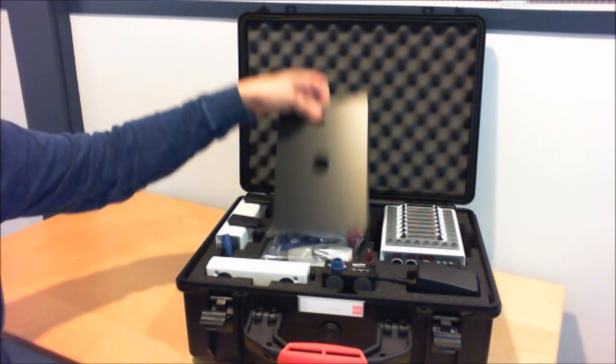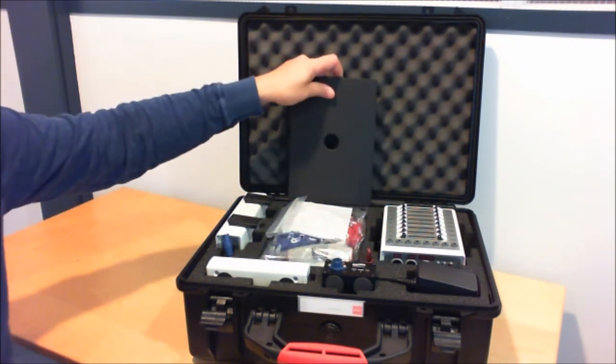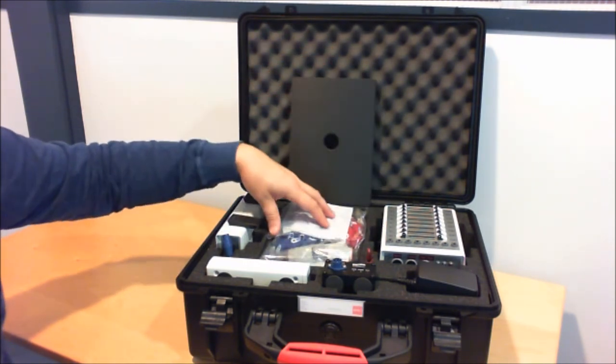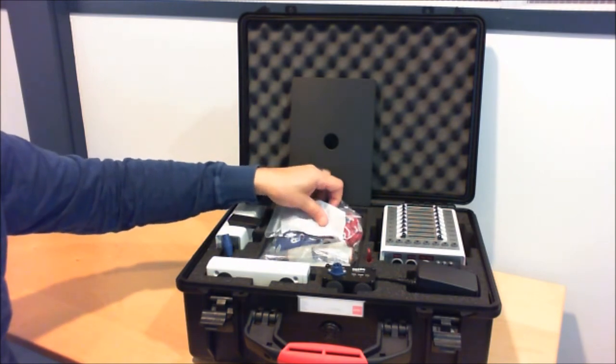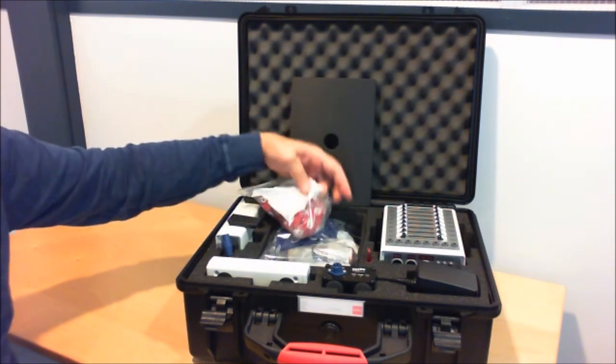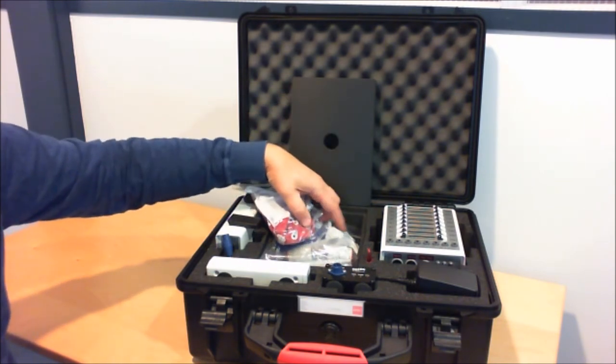Inside this small compartment there are head caps and other accessories.